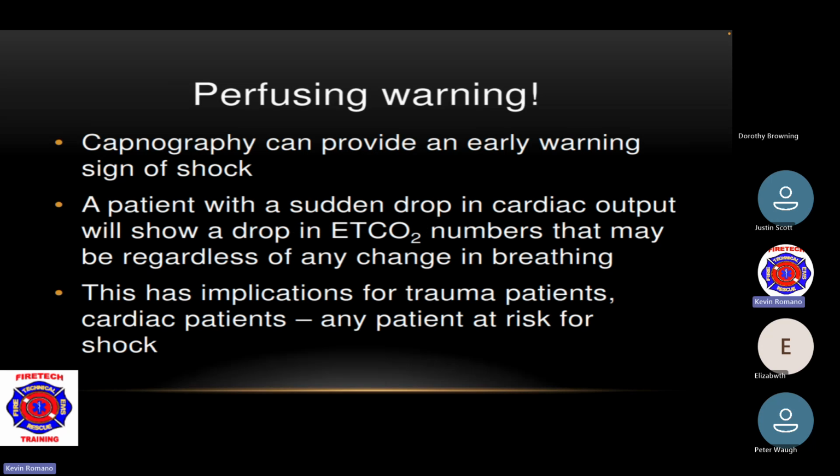Perfusing warning. Capnography can provide an early warning sign of shock. A patient with a sudden drop in cardiac output will show a drop in end-tidal CO2 numbers that may be regardless of any change in breathing.